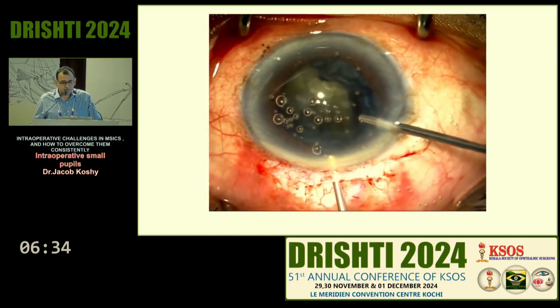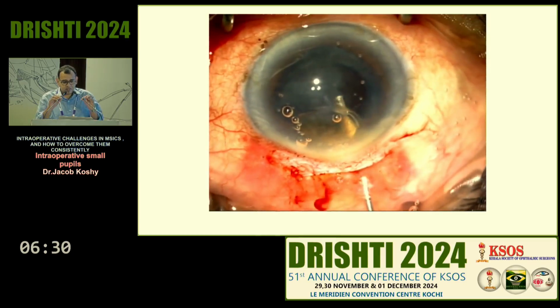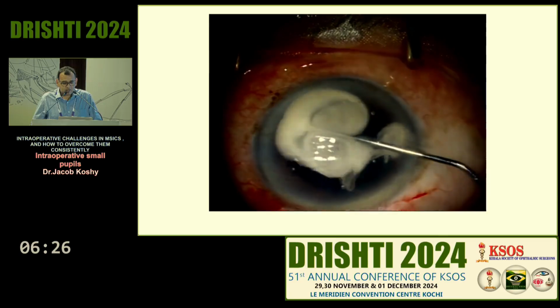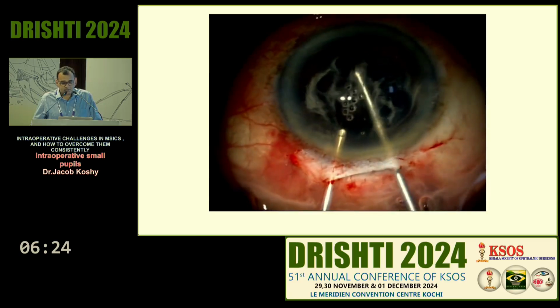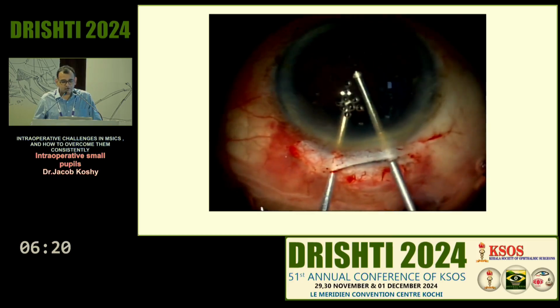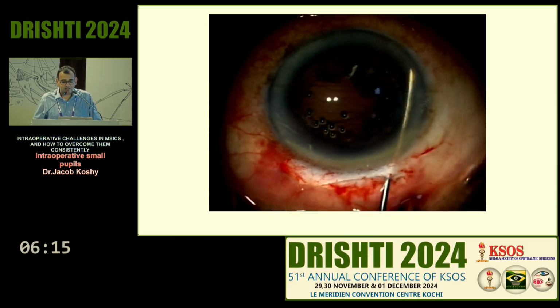Good anterior vitrectomy is mandatory in these cases, and fortunately the vitreous was a little gel, and I did a little bit of vitrectomy, cleared it up, and could get it out. Triamcinolone is a must to make sure you're cleaning up adequately. For all the VR surgeons here, things may be very easy, but for us anterior segment surgeons, sometimes it's not.